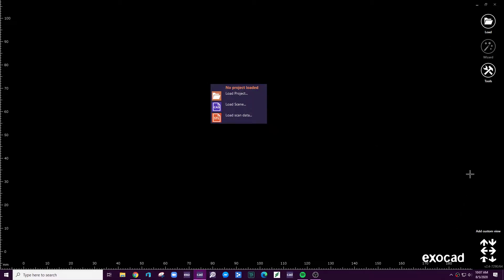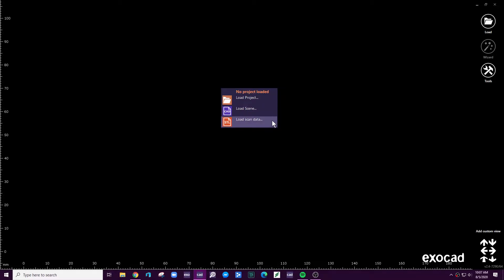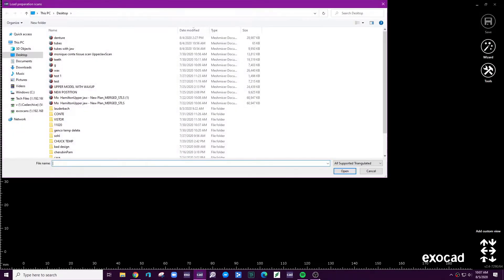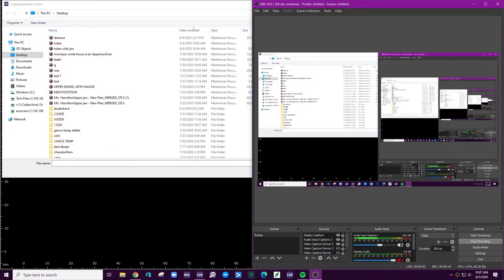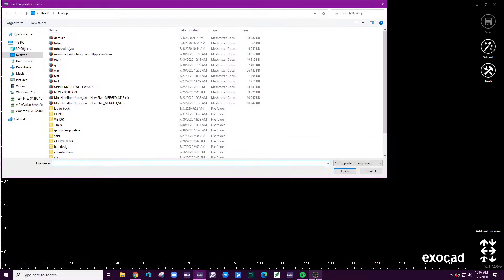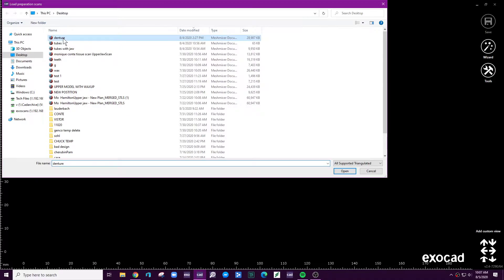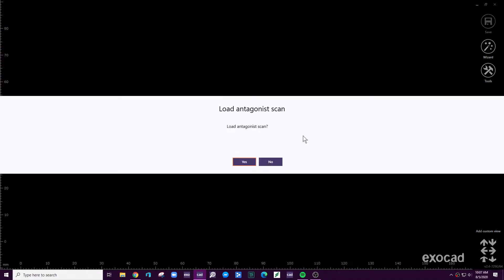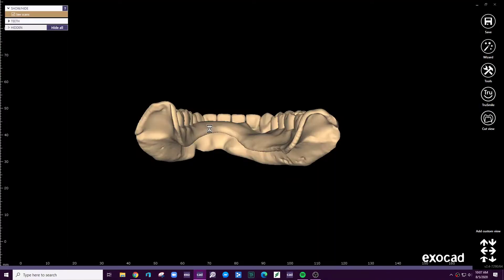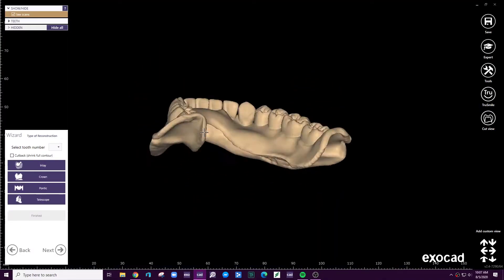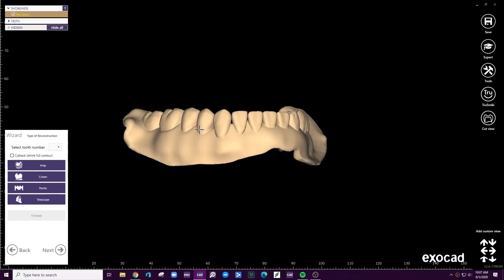So what I've done is I've loaded a blank ExoCAD window. I'm now going to go here to load scan data. And what I'm going to do is come here to click the denture. So you can see it's just a solid mesh STL.